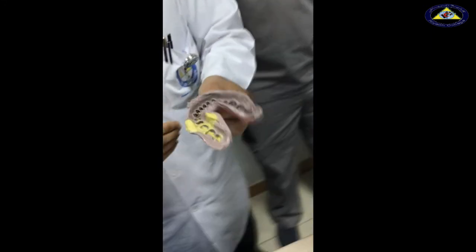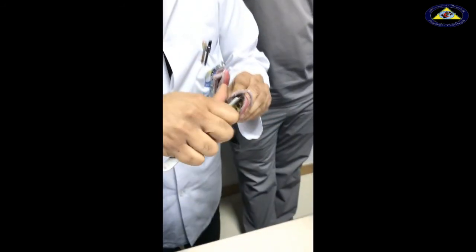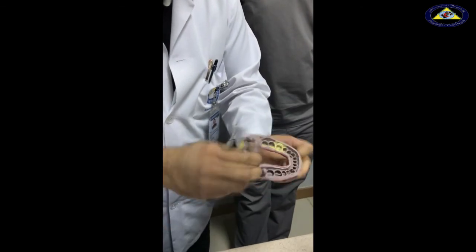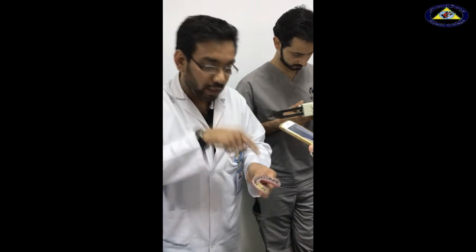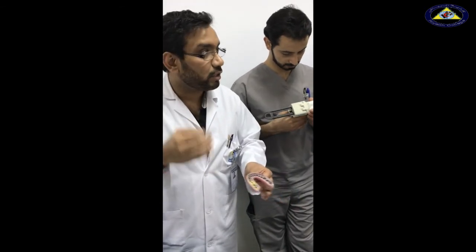Another important thing — remember your extension for your tray, which was five millimeters away from the gingival sulcus. If you made your tray perfectly, you will have no problem. You just go ahead all the way around and cut off the excess with a brand new blade. You need to be careful. Cut off all this excess and you have a nice, neat impression. The finish line should be recorded in light viscosity.